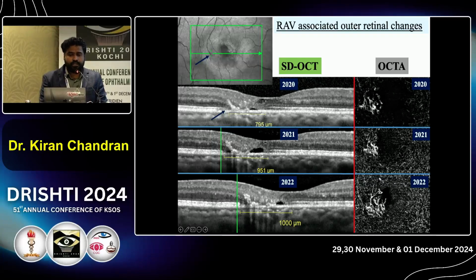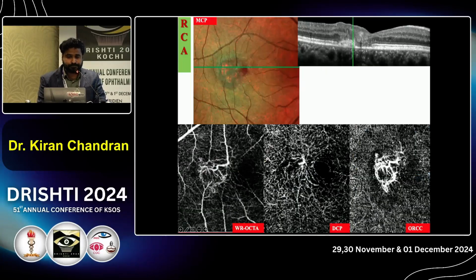And the corresponding OCTA slabs in subsequent follow-up visits show increase in the nodular hyperreflectivity to form what appears as an irregular reflectivity, but almost looks like a network forming. So this example demonstrates the formation of retinochoroidal anastomosis in Mactel.